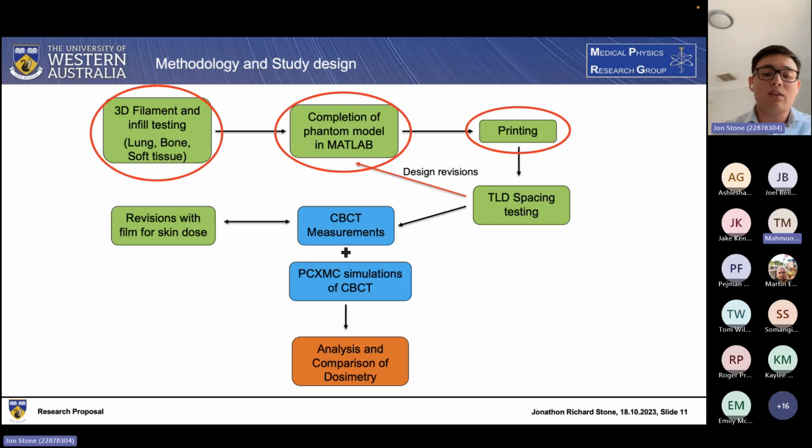But we're going to base the X-ray attenuation properties of the filaments on those of the theoretical tissues within the phantom. Okay, so you're not doing the simulation on the actual phantom; you're doing it on the basis of human body anatomy materials. Are you doing a simulation on the phantom? No, it'll be based on the phantom composition. Oh, okay. That would be interesting.